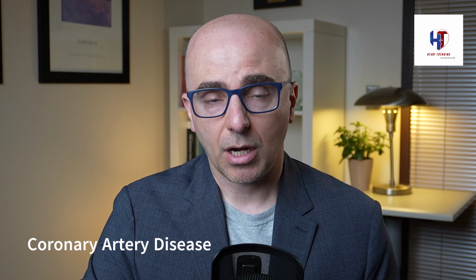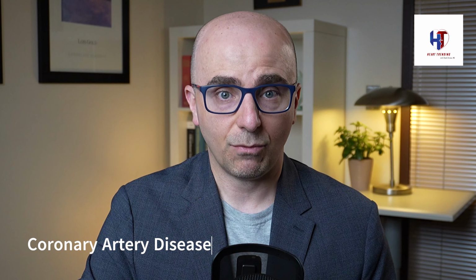Patients who have what's called coronary artery disease, or if your heart doctor tells you that you have to have what's called an angiogram of the heart, that means they found on one of the tests that you require some sort of evaluation for your coronaries.